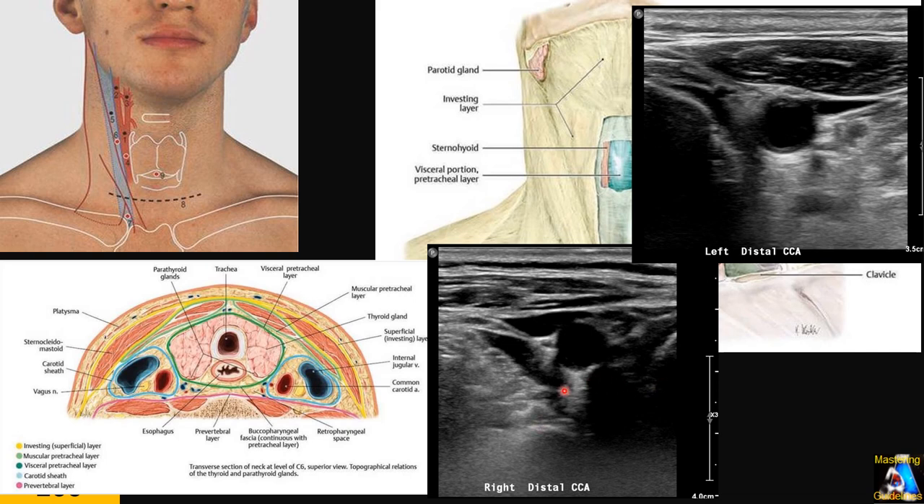You can appreciate the transverse process of the vertebra giving a posterior shadow, and the scalene muscles. You can see the same structures on the other side: sternocleidomastoid, collapsed internal jugular, and common carotid artery. Almost no thyroid gland is visible here, so this is the distal CCA on the left side of the patient.